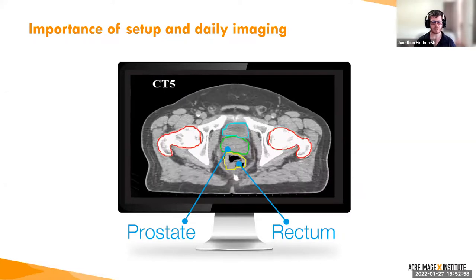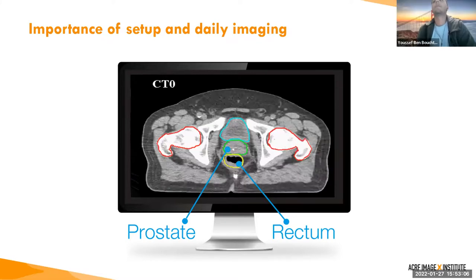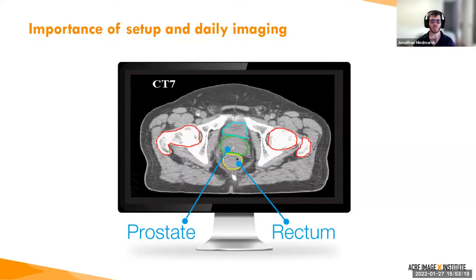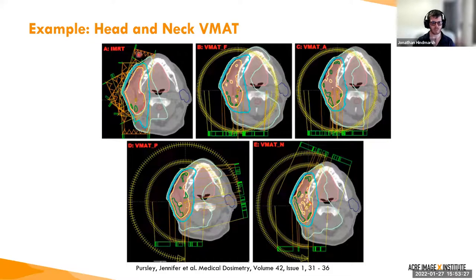Not typically in radiation in prostate, because you don't generally get patients putting on substantial amounts of weight. You typically need multiple centimeters of excess tissue or loss of tissue to see impact on the dose to the target. Where you're most likely to see this is for head and neck targets. So for example, if we took this IMRT treatment here, and this patient started retaining liquid and the skin bulged out, then that would substantially change the dose to the target. Conversely, if you start with a very bulgy tumor and that shrinks, that will also change that asymmetry.